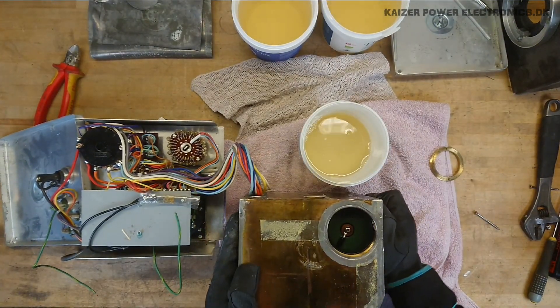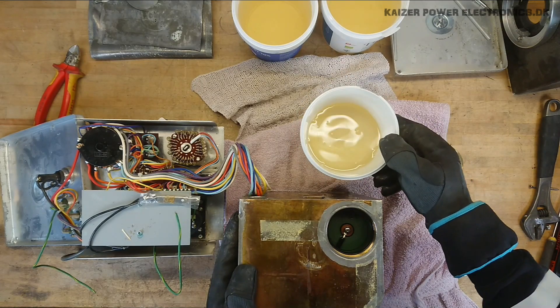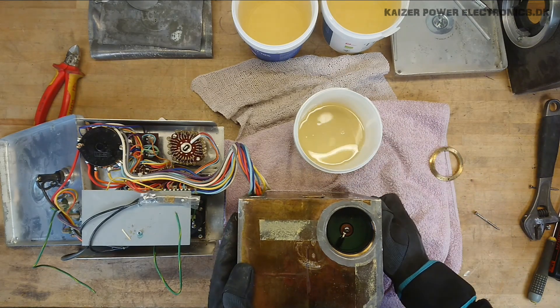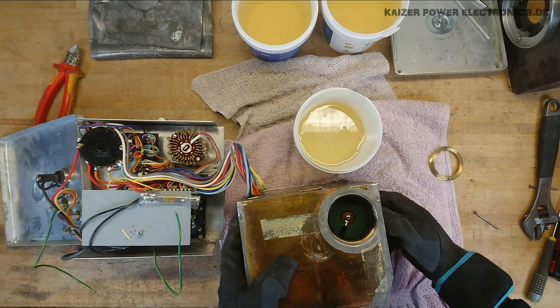I'll just turn that around now. You can also see that it does contain quite a lot of dirt — it's not exactly clean anymore after some 30 years in operation.